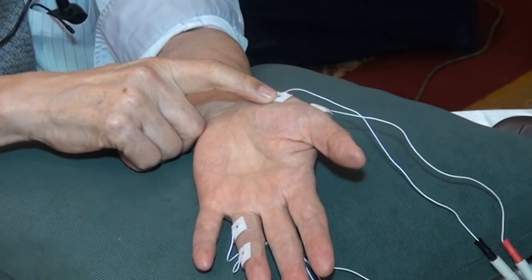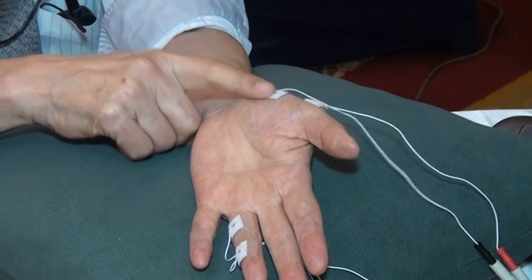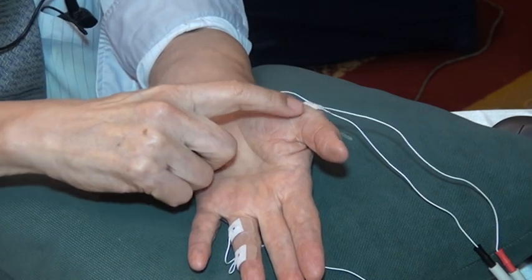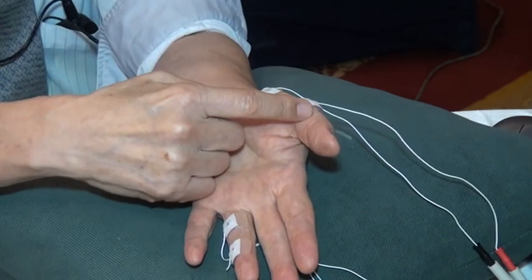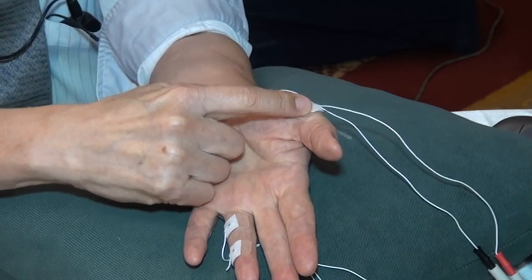So this is electrode 1, E1, the active electrode, which is on the muscle, abductor pollicis brevis. And this one is on the tendon. This is the reference electrode. This arrangement is called belly tendon recording: belly of the muscle, reference to the tendon.